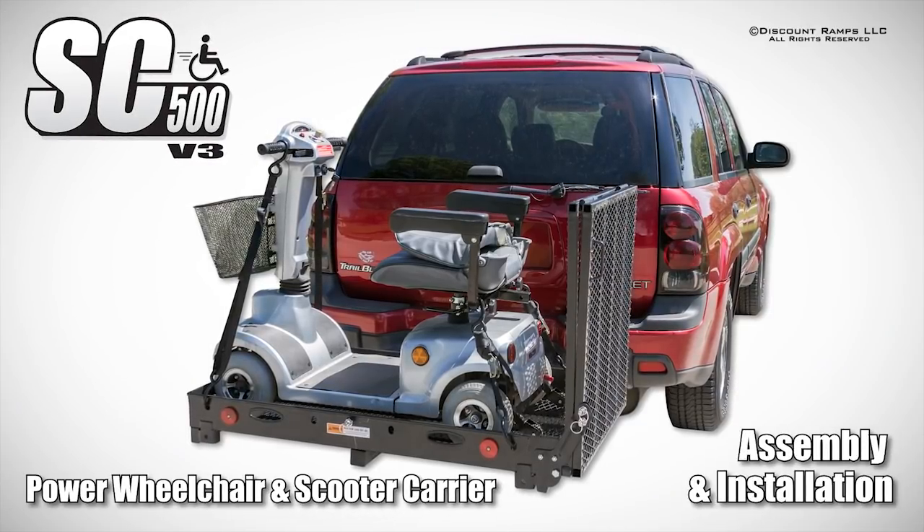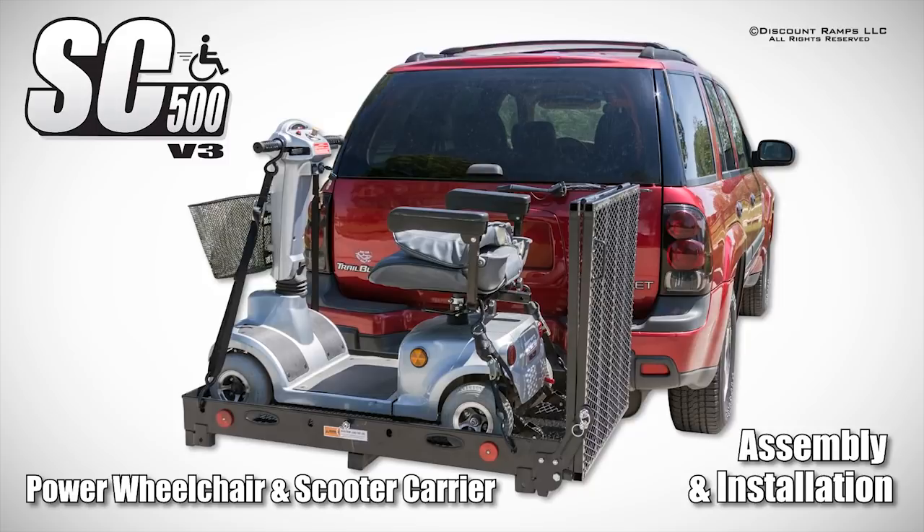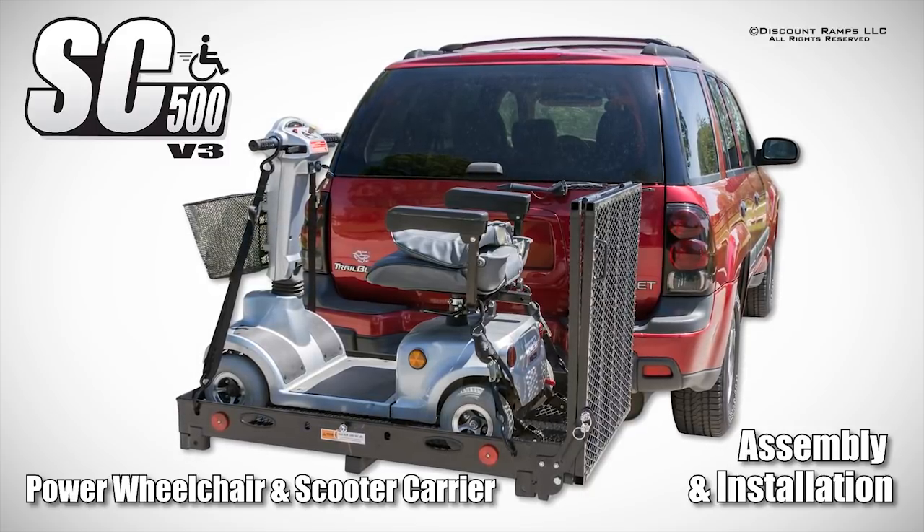Today we're showing you how to properly assemble and install the SC500 V3 mobility carrier.